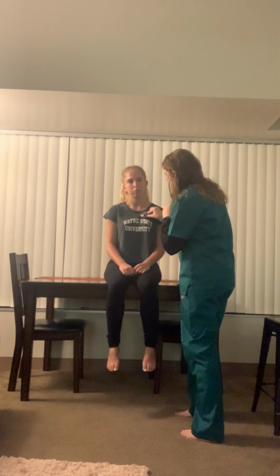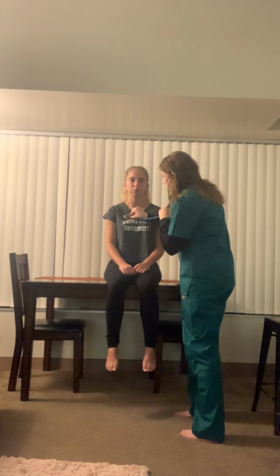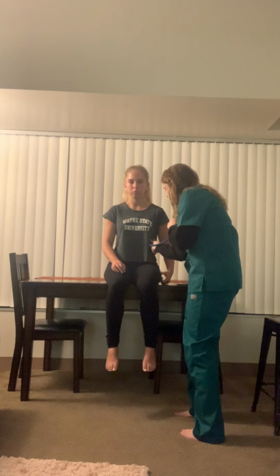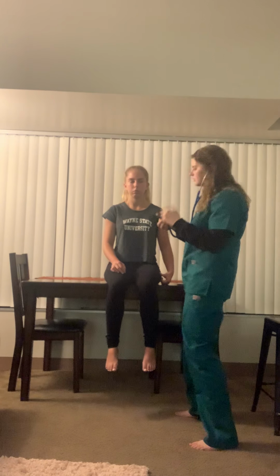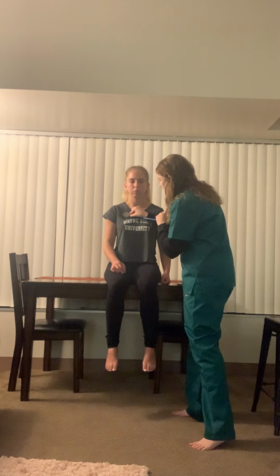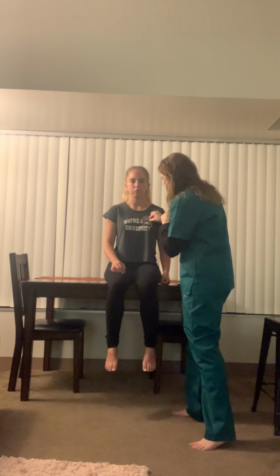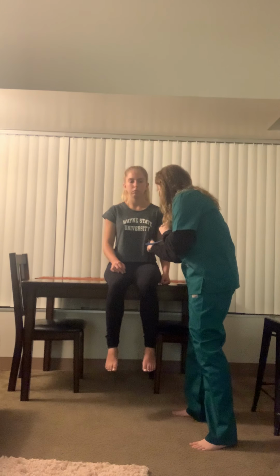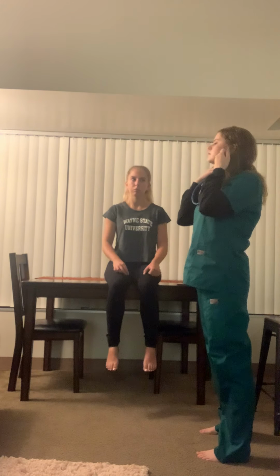First, I will start out with the aortic, and then the pulmonic, and then the Erb's point, and the tricuspid, and the mitral. And now I'll switch my stethoscope to the bell and repeat. All right. That appears to be in good order.